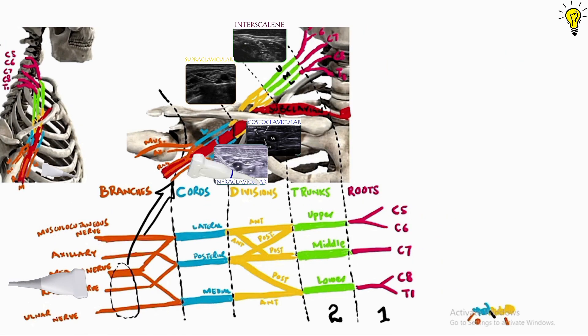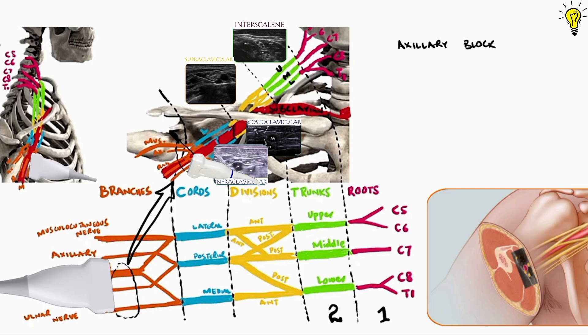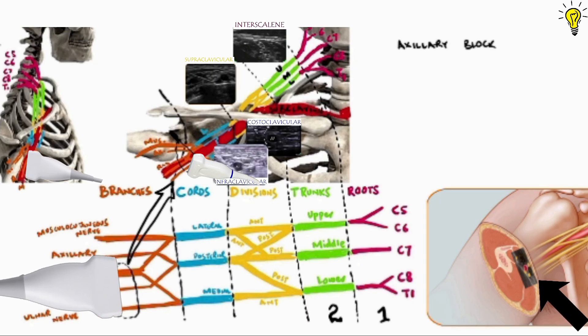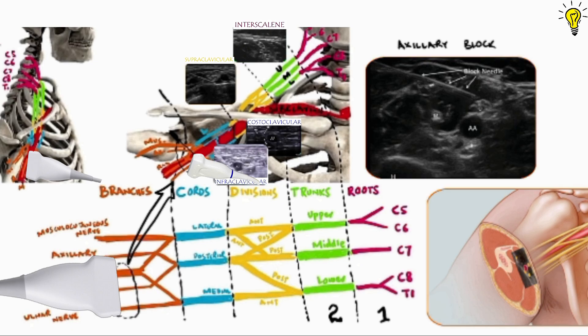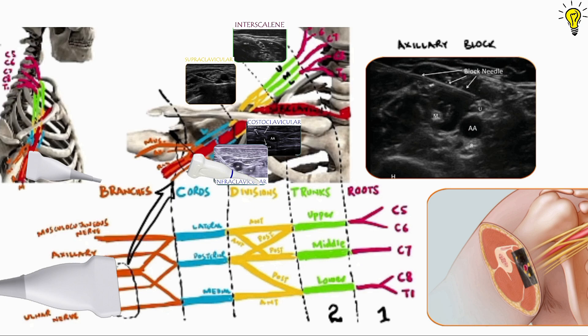Let's place transducer now in axillary region at level of axillary artery. As the probe dissects this region through the artery and nerves as shown, the image appearing in screen shows axillary artery and surrounding nerves of ulnar, median and radial. Also you can see in this image the musculocutaneous nerve in a distance between the coracobrachialis and bicep brachial muscle.